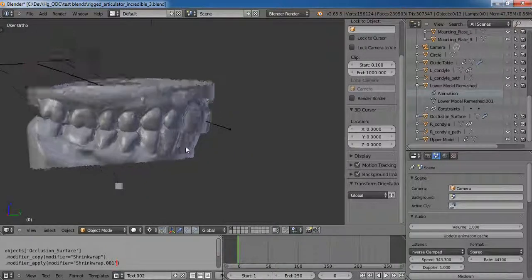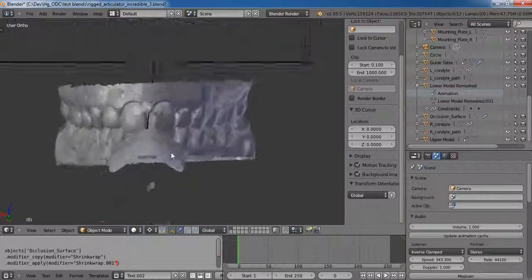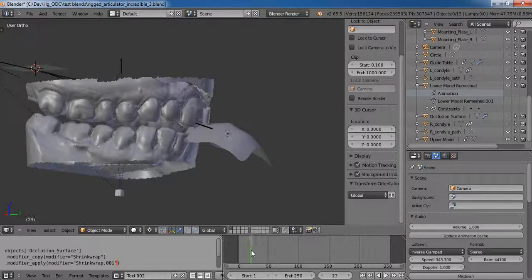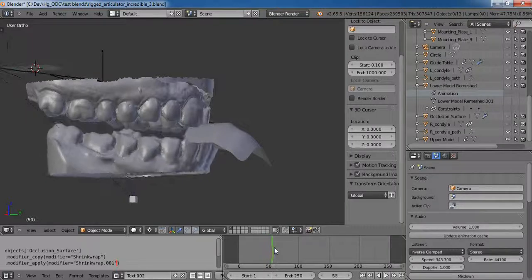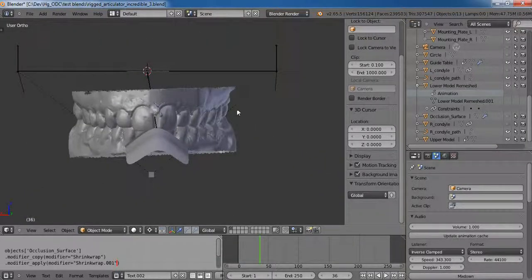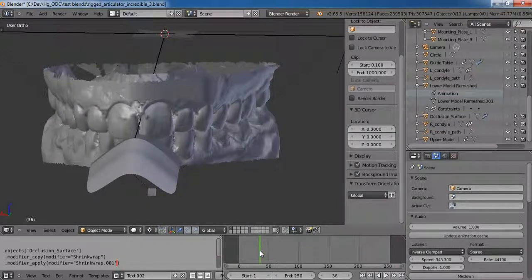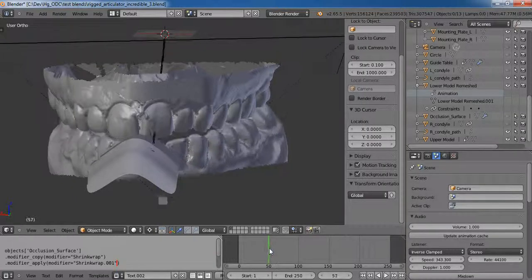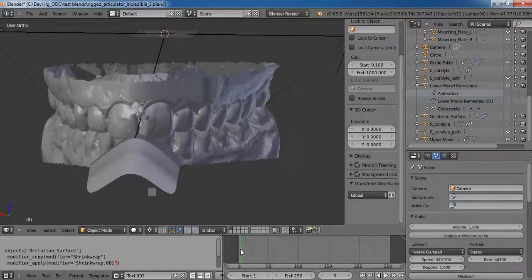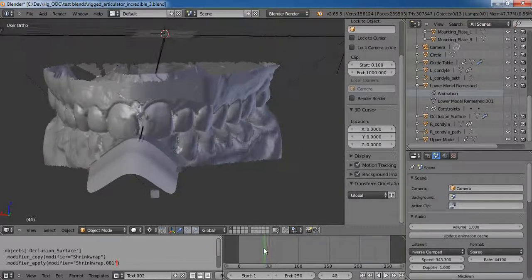And now, if I show my occlusal guide table that I've just contrived as this random surface, when we play through these animations, we can get the motions. Now, I've definitely got the size of my paths in this table relative to the size of these motions here entirely too big. Instead of about 5 or 6 frames of useful movement, the rest of which is entirely out of the scope of what would be normal ranges of motion, I have to tune this a little bit to get it where it needs to be.